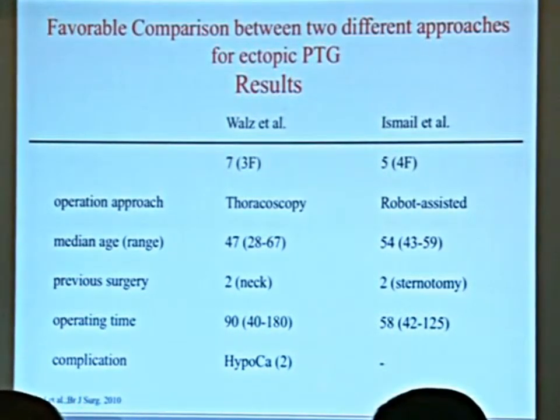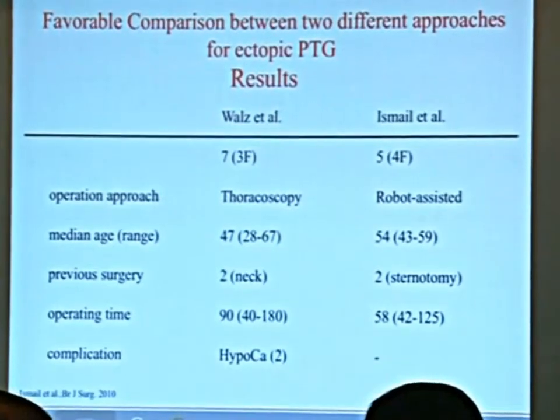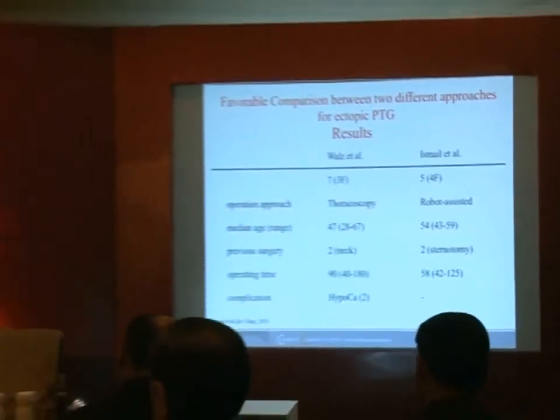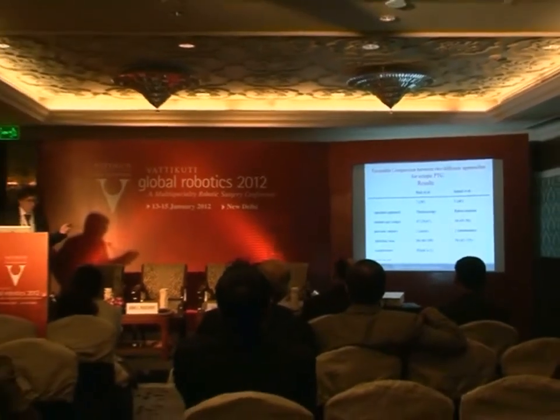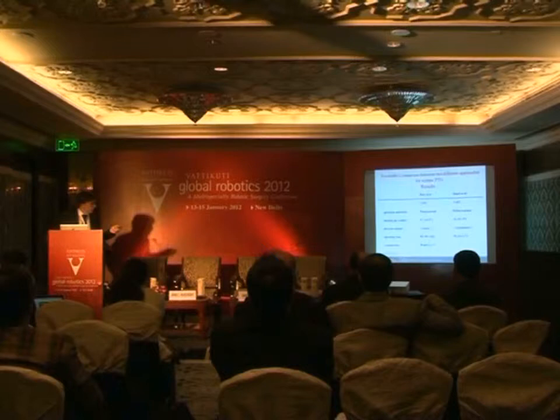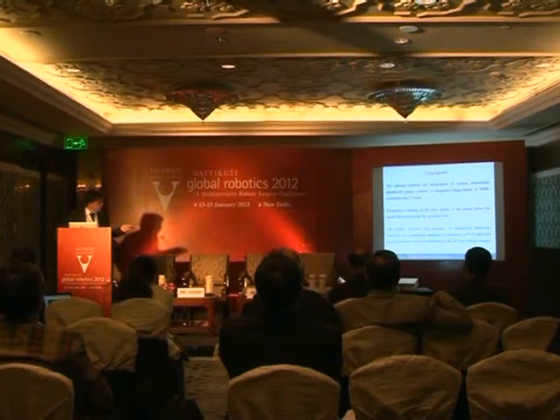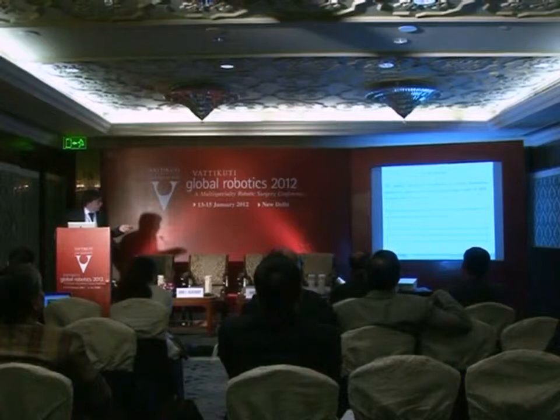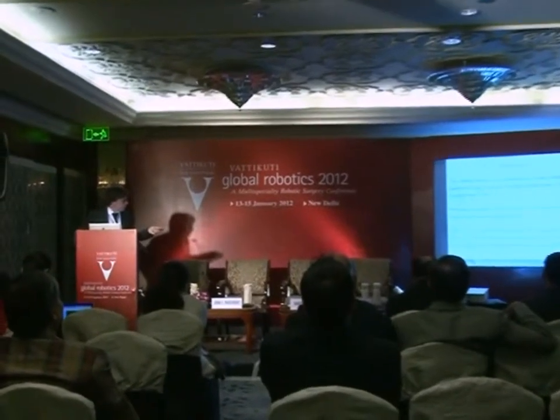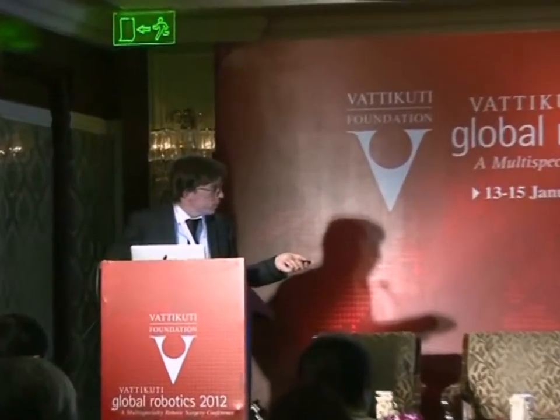And there should be a policy of centralization of these cases, and there should always be an opportunity, even now in India, to send these patients to a center with robotic opportunities. So the optimal method for localization of ectopic mediastinal parathyroids consists of integrated image fusion, MIBI and CAT scan. Preoperative marking on the body surface of the patient allows for secure dissection inside the operation field.